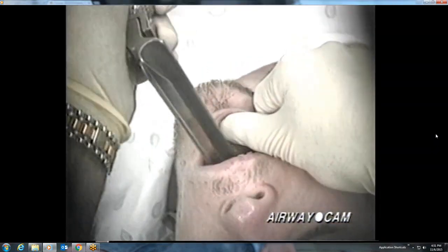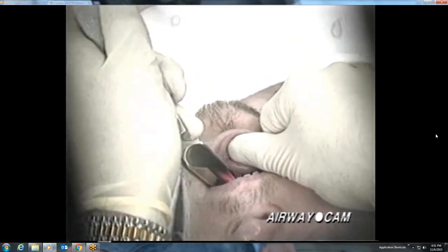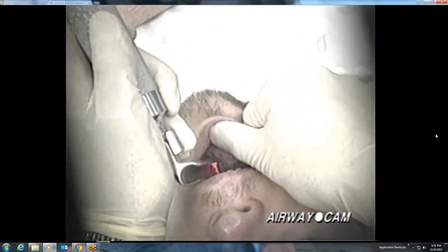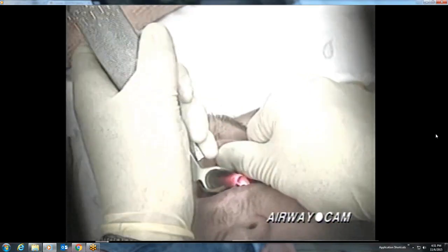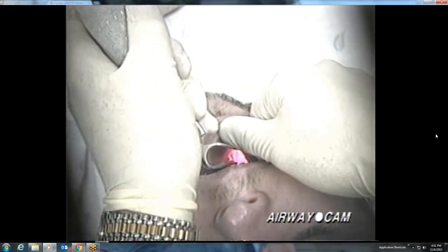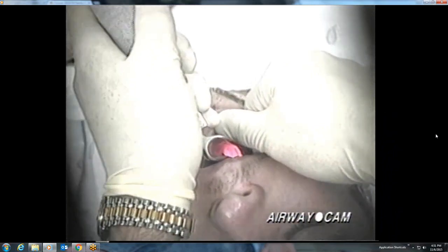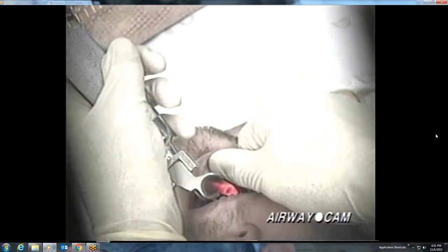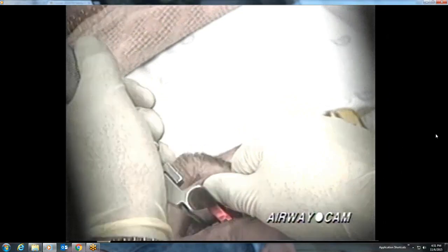Returning to a straight blade, this next intubation initially demonstrates how placement of the blade on the left side causes the tongue to completely obscure the view. After repositioning the blade correctly down the right side, the laryngoscopist makes repeated attempts to pick up the epiglottis. The laryngoscopist also maintains a scissor technique to keep the mouth open, thereby aiding visualization. Once the epiglottis is positioned beneath the blade, elevation in the direction of the handle results in a good view of the true vocal cords.